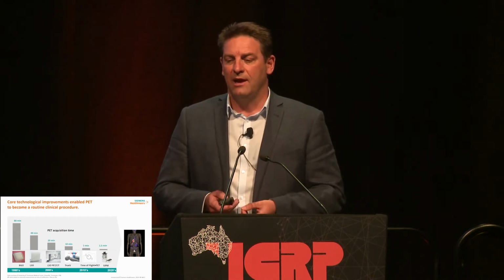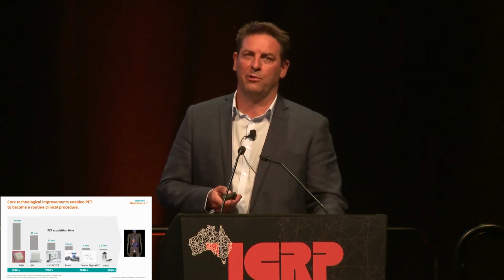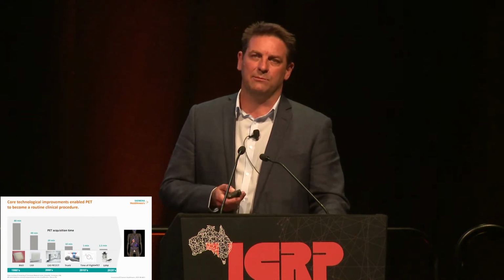We saw the introduction of LSO-based scanners in the late 90s, and then around the turn of the century we saw a really big change with the introduction of CT scanners, another modality which enabled us to better anatomically localise where we were seeing tumours or lesions in the body, and we also used that for attenuation correction. Early 2000s we saw an expansion in the fields of view. Time of flight imaging came in around 2010, and in the last couple of years we've seen a significant improvement with the introduction of silicon photomultiplier detectors, which replaced the PMT or photomultiplier systems that were available previously.